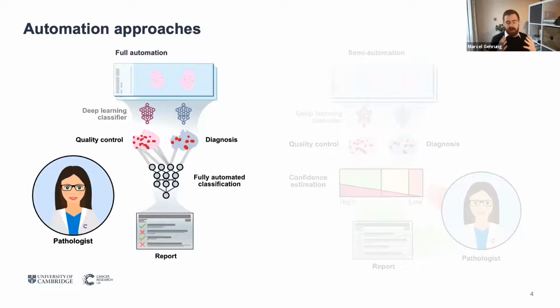And why make a differentiation between the H&E stain and the TFF3 stain here? That's because after working very closely with Maria O'Donovan and her colleagues and the pathologists who are very familiar with reporting the sample type, from a computational perspective, we basically divide the analysis of Cytosponge into quality control, which is mostly referring to looking at the hematoxylin and eosin section, where we are trying to find gastric columnar epithelium to check whether the sponge has traveled all the way into the stomach. And the TFF3 biomarker we're using for the diagnosis to check for the presence of intestinal metaplasia.